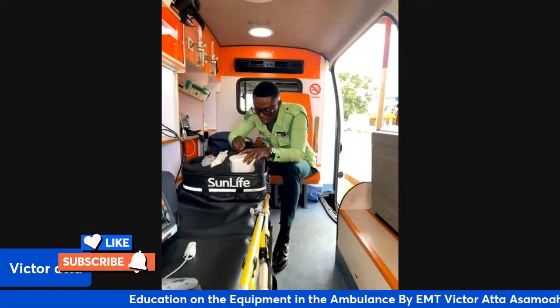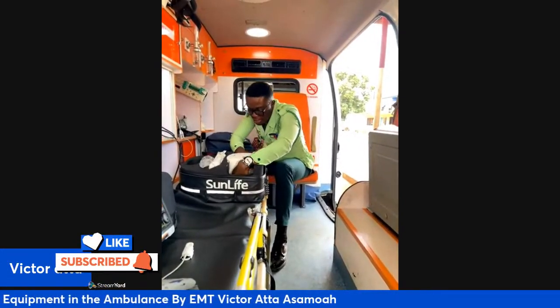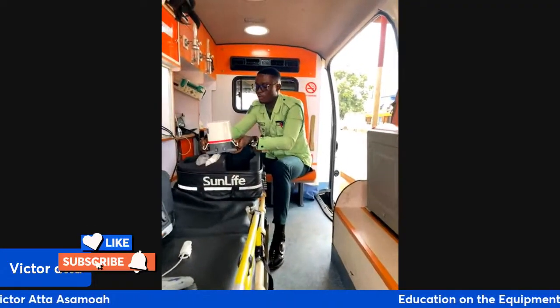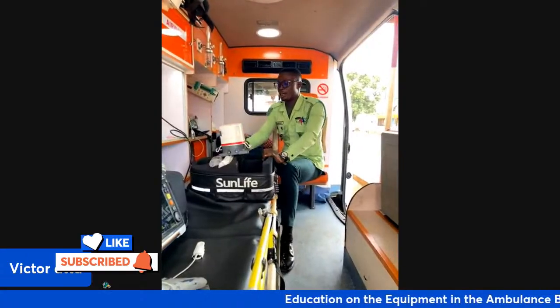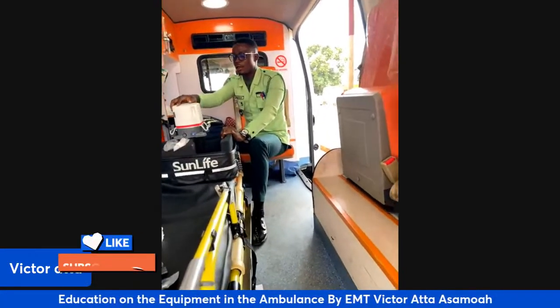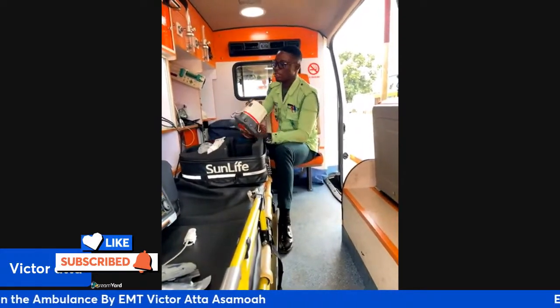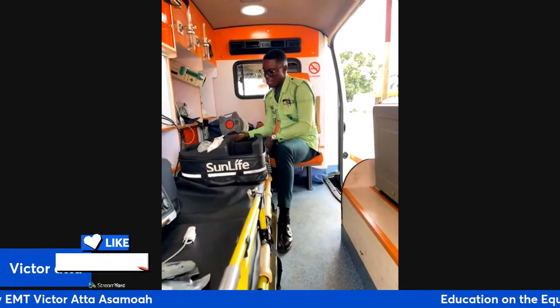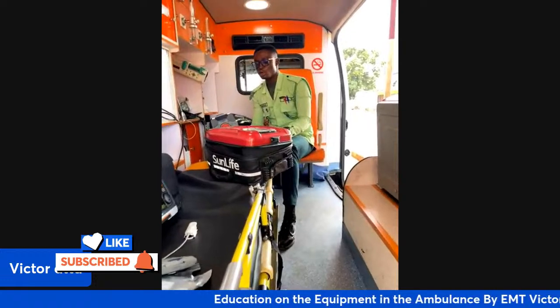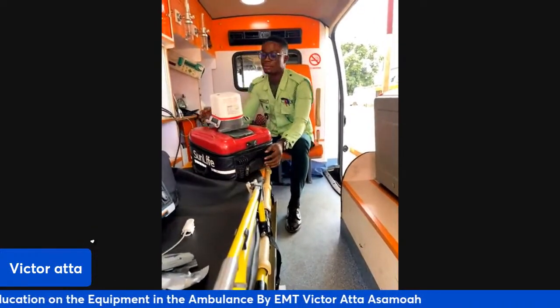But our able leaders have come to realize that sometimes when an EMS provider exhausts all his or her energy, you need an external or different machine that will allow the EMS provider to do his work very diligently. So this is the automated chest compression system, Sun Life.